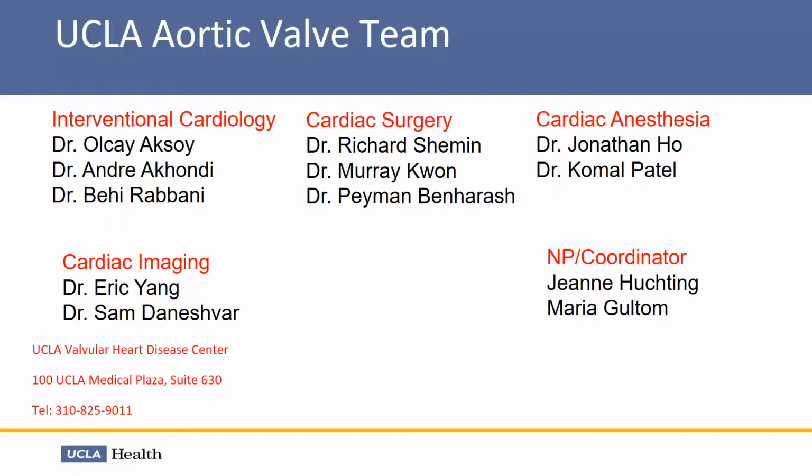We have had patients who had left atrial thrombus, appendage thrombus. We actually did some TAVRs on patients who have apical thrombus, and we used a filter on that, and that worked out fine. But routine use of filters is pretty rare in the US. Occasional PRN use as high risk use is more common. And that's sort of what we're doing.